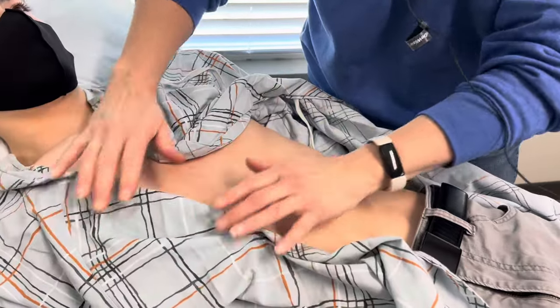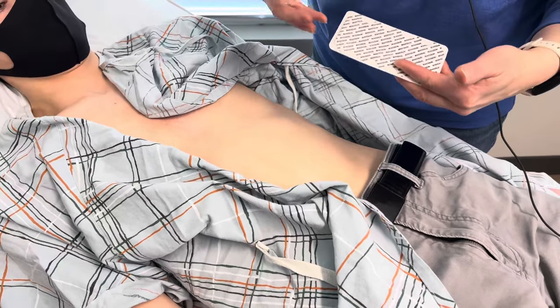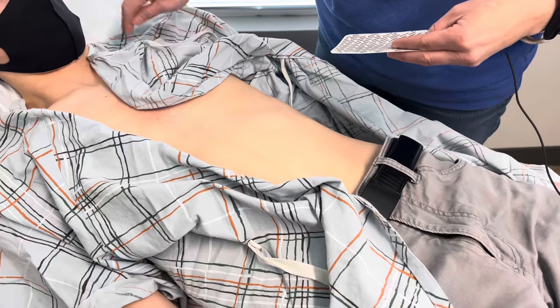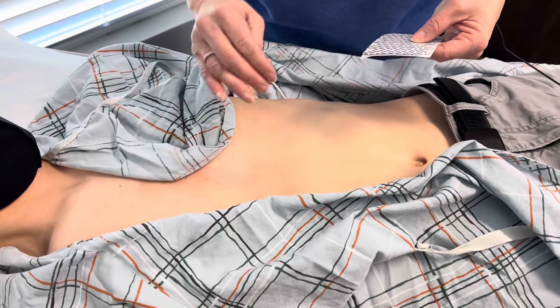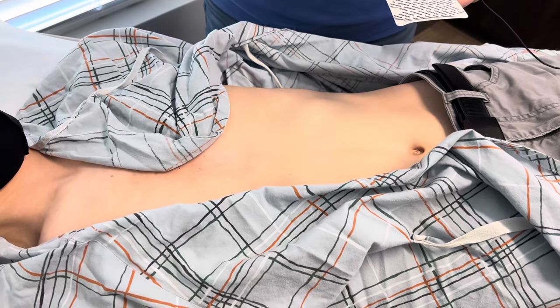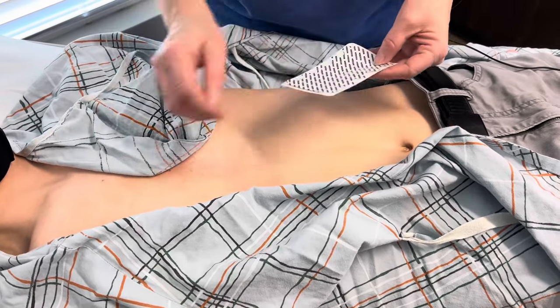First we're going to put the leads on — you're going to find these little electrodes. If you take a few minutes to prepare the patient, it will give a much better reading for the provider. Make sure there's not a lot of hair; if there is, shave it off first, because these have a sticky back and won't stick well otherwise. If the skin is really oily or has a lot of lotion, clean that off. Avoid alcohol if the skin is really dry, as dry skin won't transmit electricity well — think of ultrasound gel. If you can't get them to stick, you can use a little bit of gel as well.